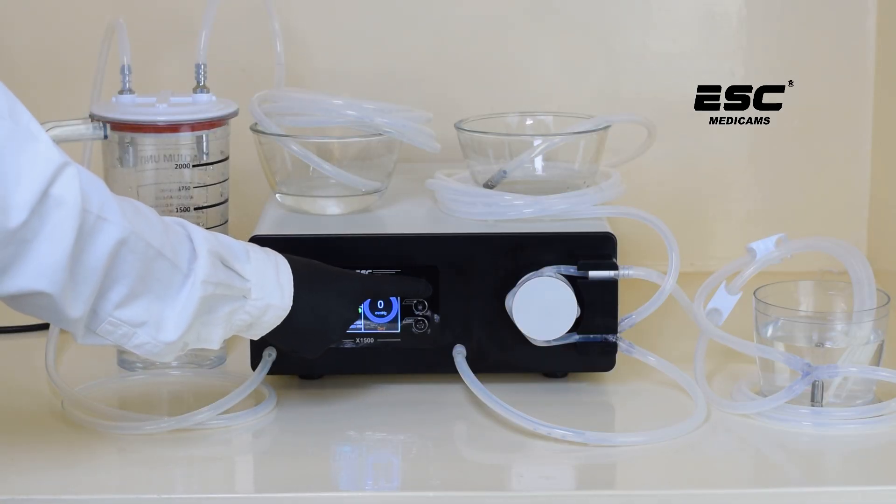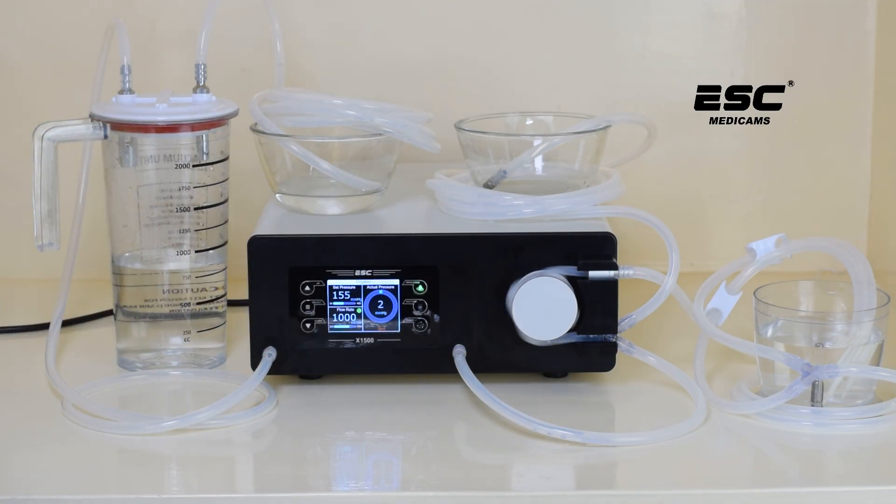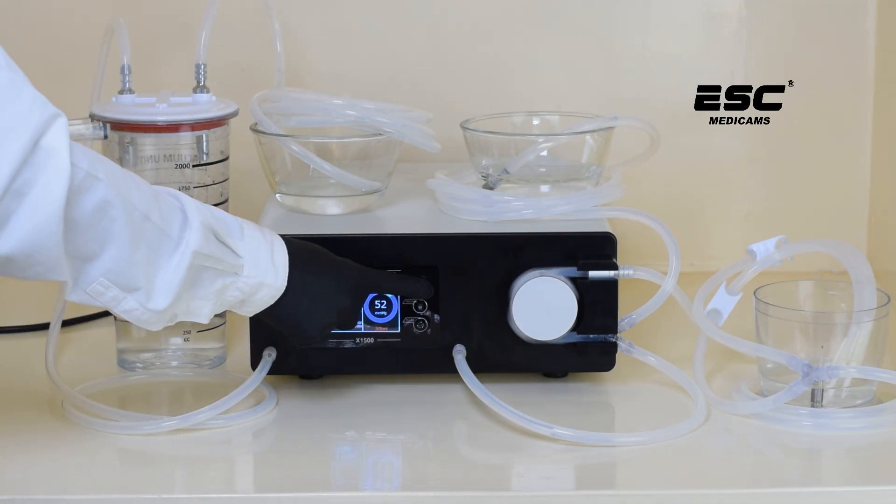To start irrigation, simply press the irrigation button. To stop, press the irrigation button again.